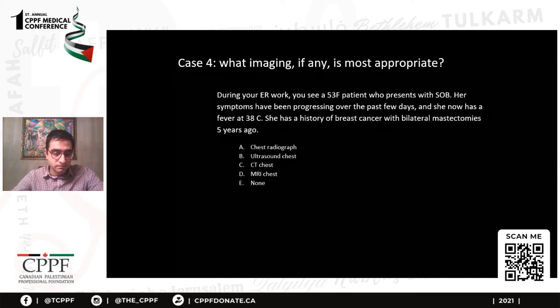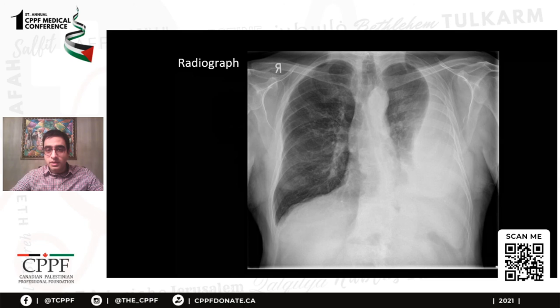Okay, time is up. And the correct answer is a chest radiograph. It's the first line imaging modality in this case. So you do the radiograph, and this is what it looks like. So I'll give you a little bit of time. Just take your time and see what you can make out in terms of the findings.